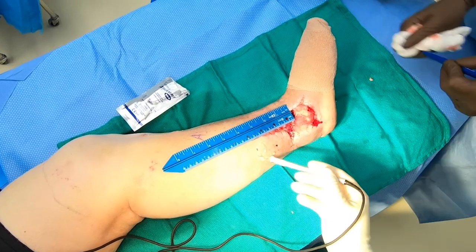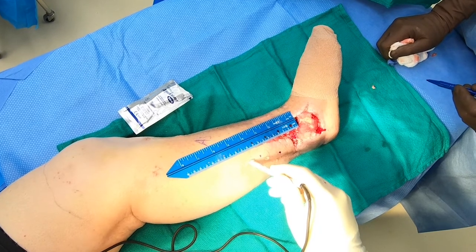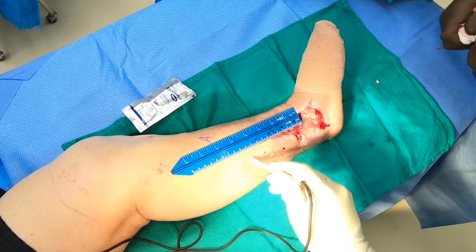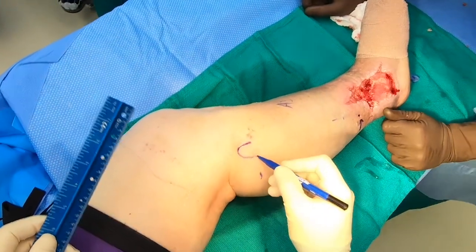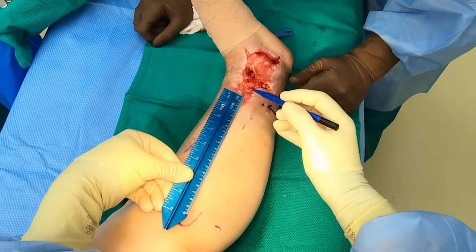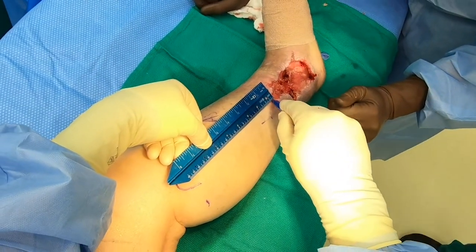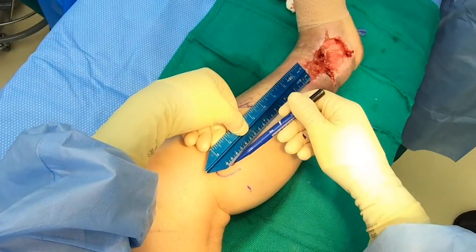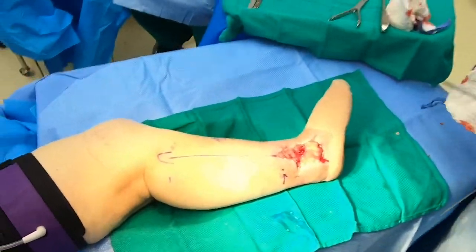We try to identify as many perforators as possible moving proximally along the leg. In this case, we were able to clearly identify two, maybe three, clear perforators using the Doppler probe. We draw a line centered on the fibula and running the entire length of the fibula and directly into the soft tissue defect for complete harvest and anticipated insetting of the peroneus brevis. Local anesthetic is injected using 0.25% bupivacaine along this line.